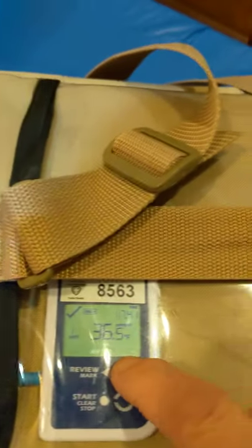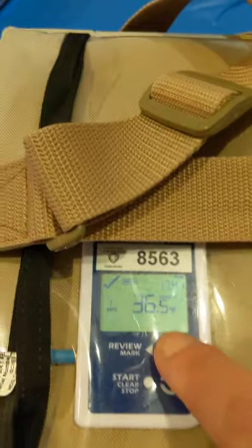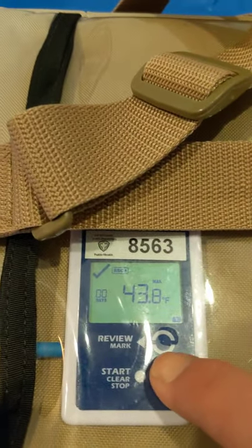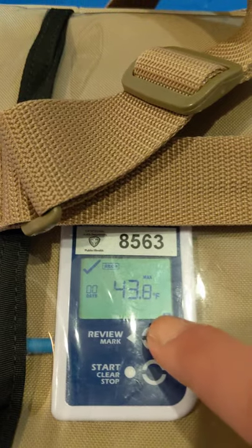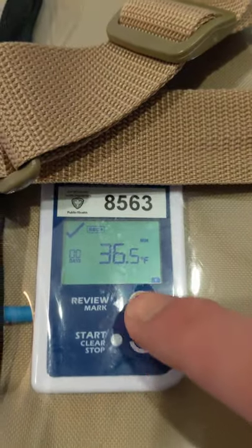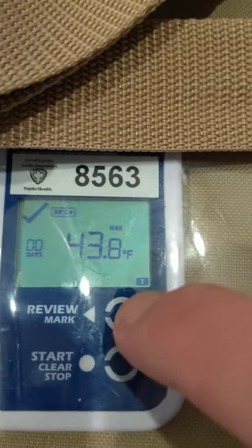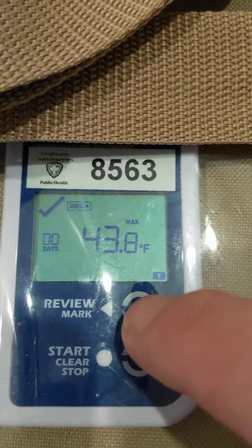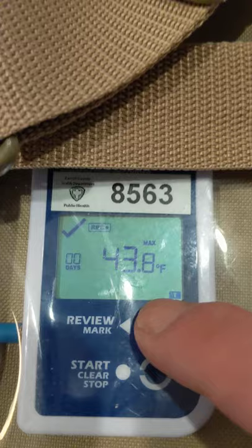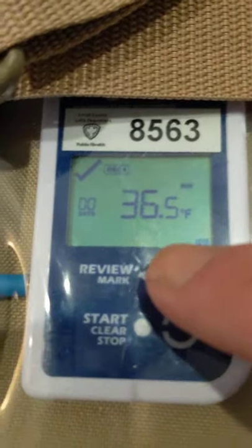Every time you have an event or anything you want to make a note of later, just push this mark button. This is the review button — if there had been any excursions, it would have told you. It is now going; you can see it says the minimum. When you push it again, it says it's reached a maximum of 43.8 degrees, and then press it again and it goes to the minimum.